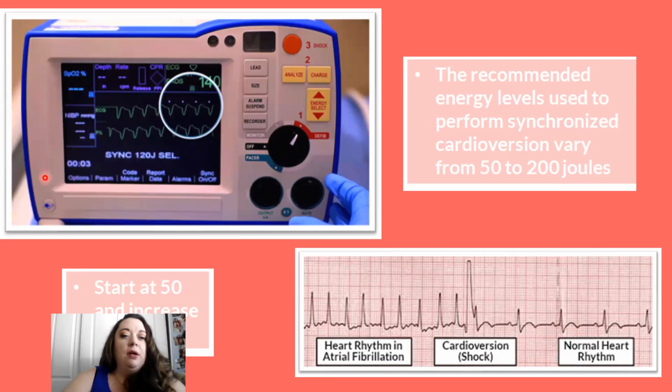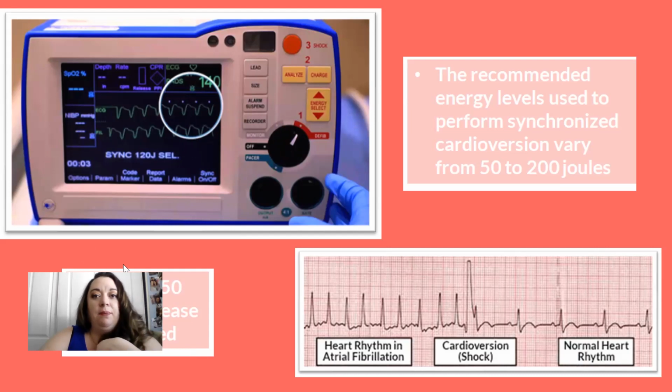Do you guys remember, because I think we talked about this in at least one group, what happens if I try to sync up, like I try to read the patient's rhythm and shock at the right time? Do you know what can happen?